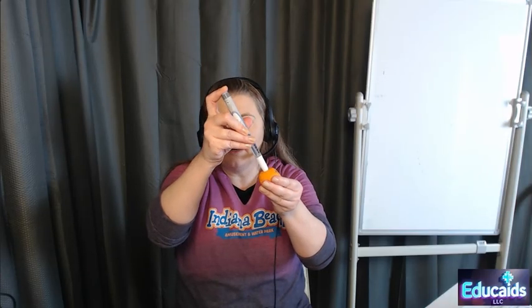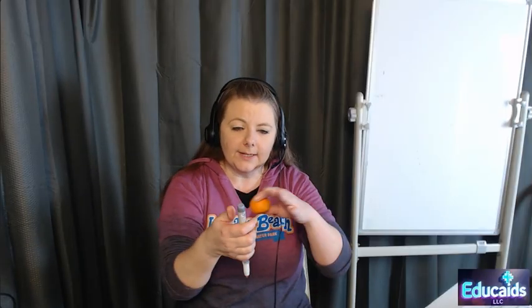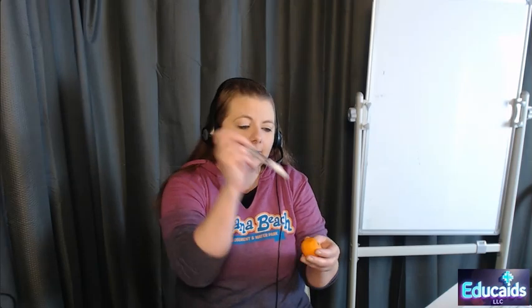1 banana, 2 banana, 3 banana, 4 banana, 5 banana, 6 banana. You have to hold it on there for 6 whole seconds after you have depressed the button. Otherwise, the patient's not going to get all of their medication. This is a spring-loaded mechanism in here, and if it doesn't stay in contact with the patient, they're not going to get all their medication. All right?